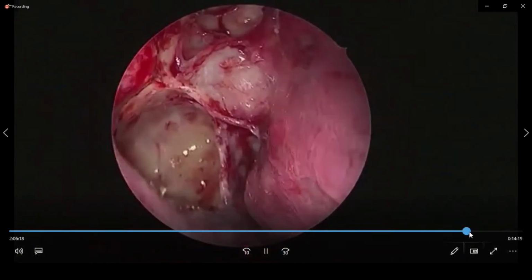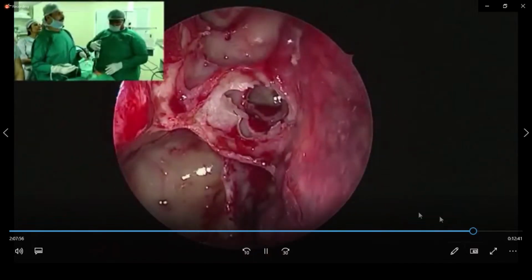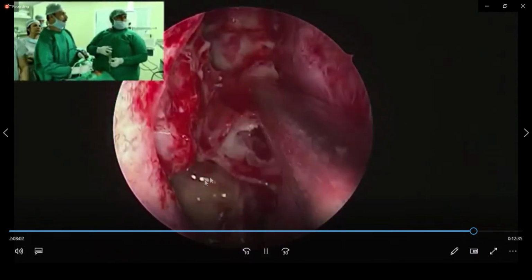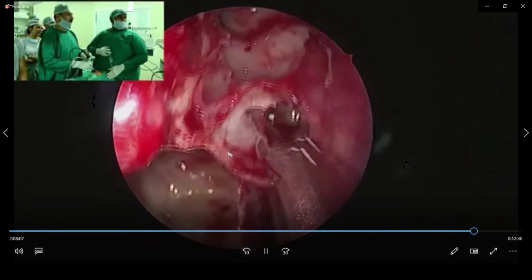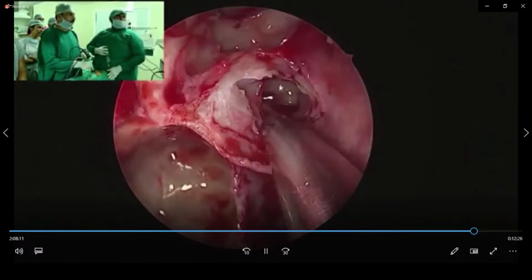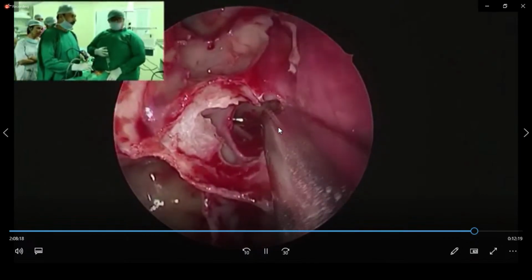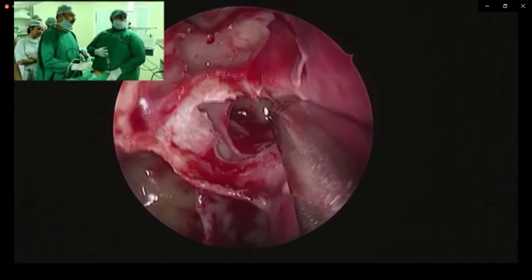we enter into the ground lamella medially. See this. We enter into the ground lamella medially, just a medial entry into the ground lamella, and this maxillary line is the key. As you go medial, you will see the superior turbinate in this window. We made a window medially into the ground lamella. I am not keen to do a posterior ethmoidectomy first. I never know when I can accidentally enter into the sphenoid sinus.